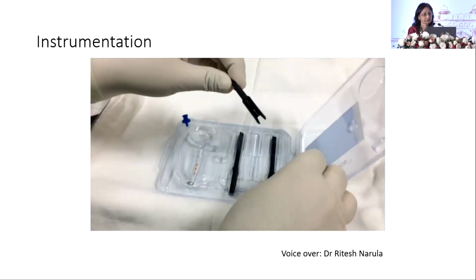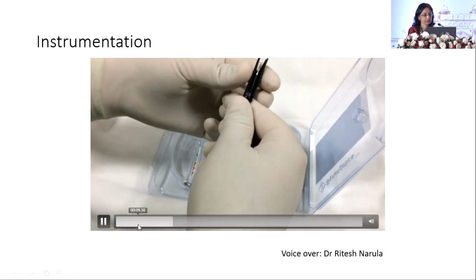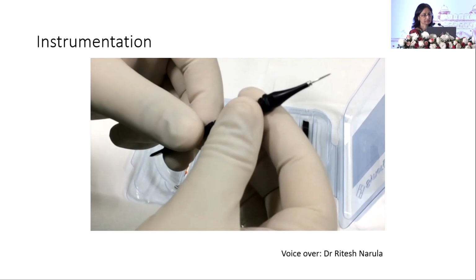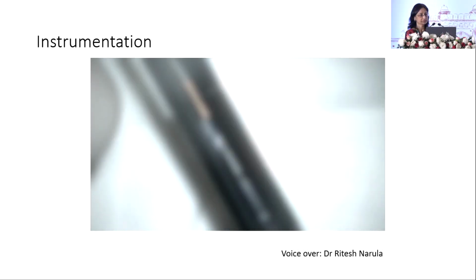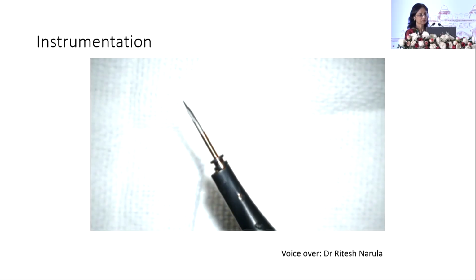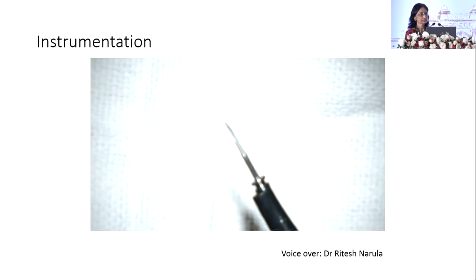Infusion pipe and 3 scleral plugs. Trocar cannula consists of a sharp spear-shaped trocar threaded over which is a round-bodied cannula.